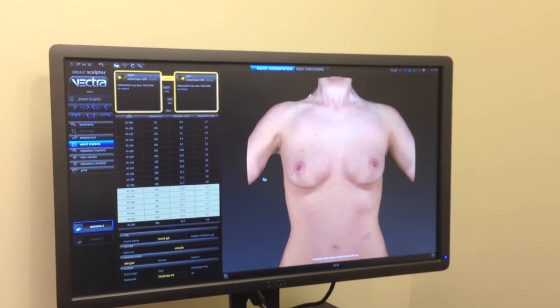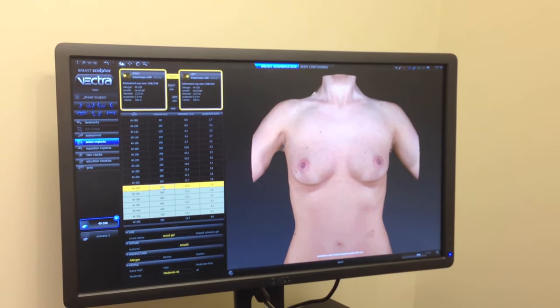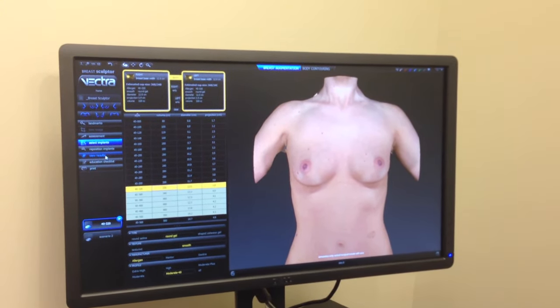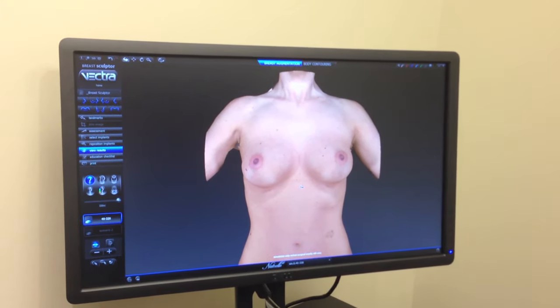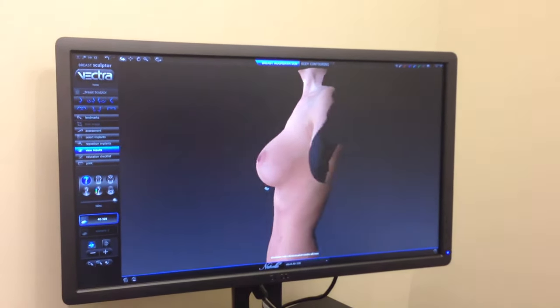I think for her we're going to start with maybe a 320cc implant, which is this category right here, and we're going to view her result and you can actually see her breasts change sizes. And then, not only can you see the breasts change sizes from the frontal view but I can actually turn her over to the side and you can see her from the side view.